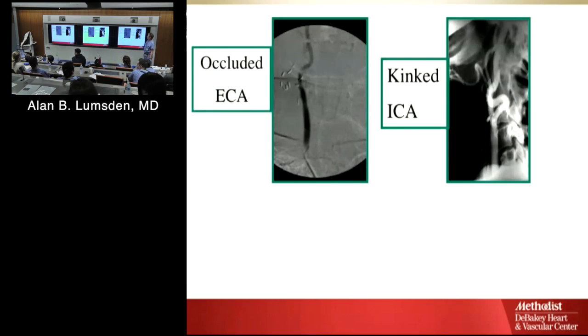We would probably do a 3D, and on the GE you can track the entire vessel. You have to take the probe up and over and around, but it can be hard. And most likely you're going to have increased velocity in the kink. So you're not going to call it a stenosis when you see the kinking and your velocity is 150, for example. And we see that kinking, as you said, in older people. It's very interesting how this kinking happens more.